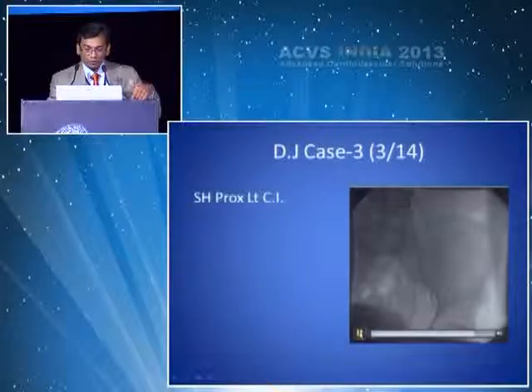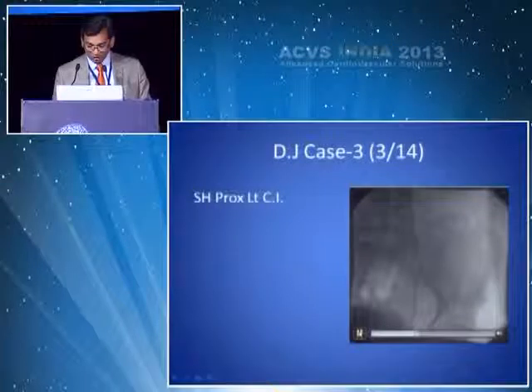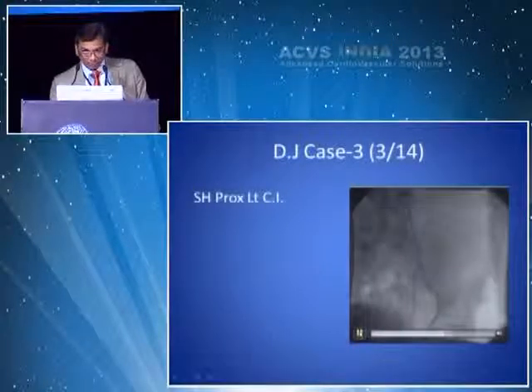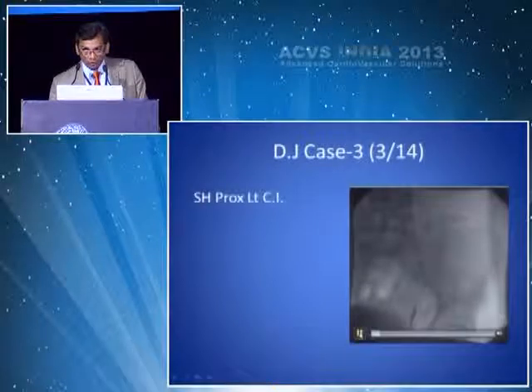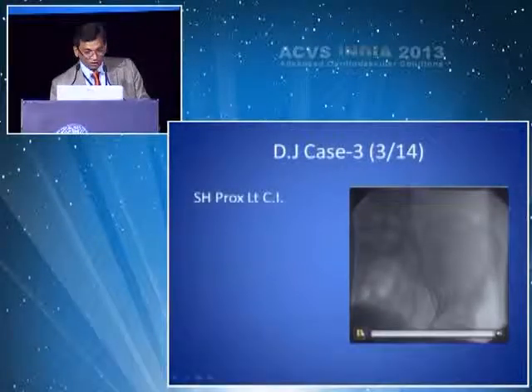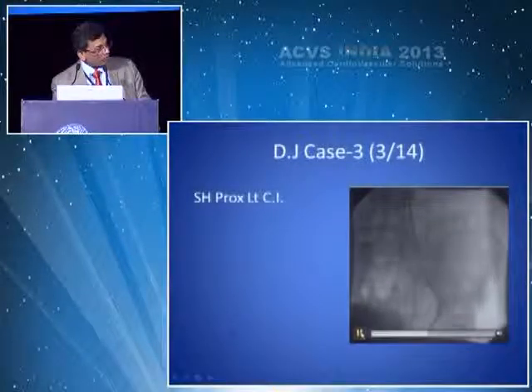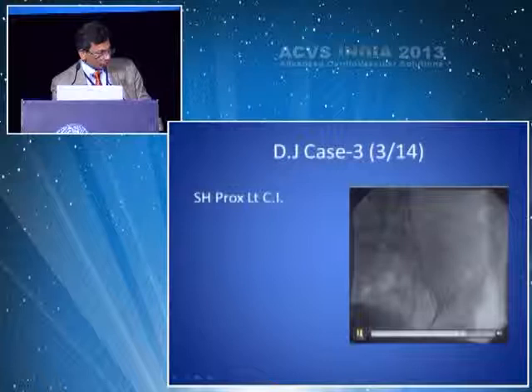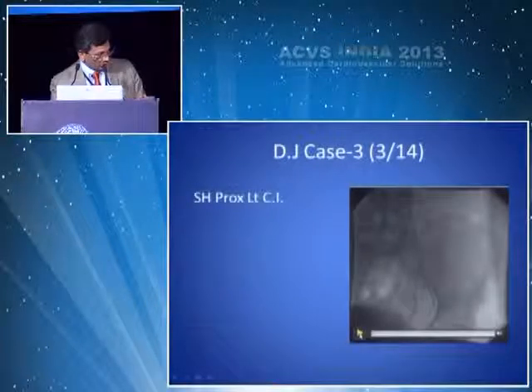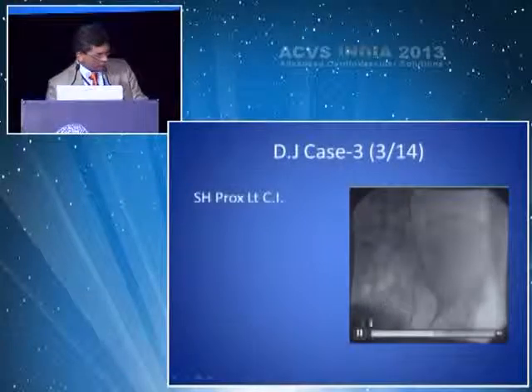So then we went down, put a long sheath, and did primary Silverhawk atherectomy. One question people have when I talk about atherectomy for peripheral vascular disease using Silverhawk is: how far can the device reach? As you can see, with the technique I used here, it reached the proximal lesion just about. And for the distal lesion, as we Silverhawked, we actually advanced the sheath, so you get better length on it.